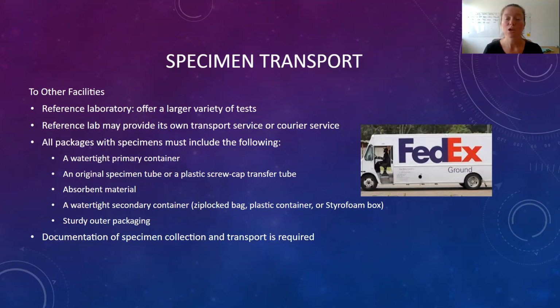Typically when we're doing this, we are going to have our labeled specimen put into a bag with some sort of absorbent material or absorbent sheet. This is there for if we have that leak or break or whatever, it's going to absorb that material. Typically, these bags have a separate pocket from where the specimen is contained for paperwork. And that is also to prevent that paperwork from being damaged, again, if there's some sort of break or spill.